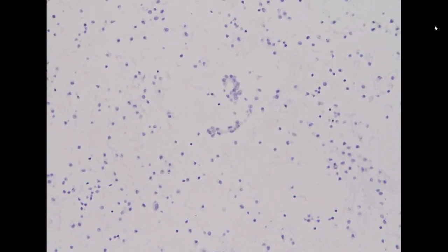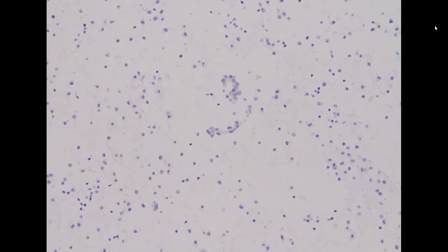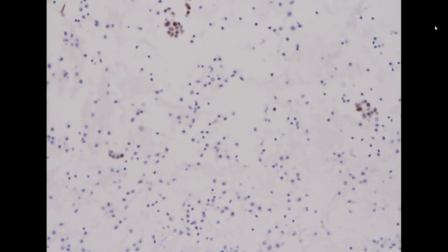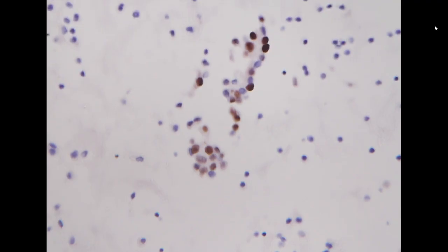So for the differential diagnosis between metastatic carcinoma versus mesothelial cell, what we like to perform is claudin 4. So this is a new marker, and it's supposed to be very sensitive and specific for epithelial cells, particularly glandular cells. So the claudin 4 for the cell cluster is negative. I also did a TTF1, which is negative. I don't think it is squamous cell carcinoma, so I didn't do P40. And then I did calretinin. So calretinin is the marker for mesothelial cell, right? So this cluster is positive for mesothelial cell.